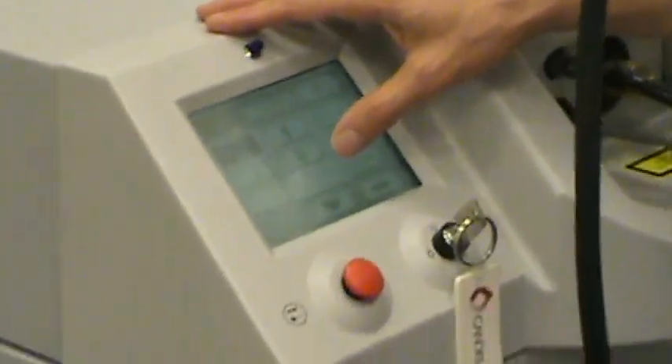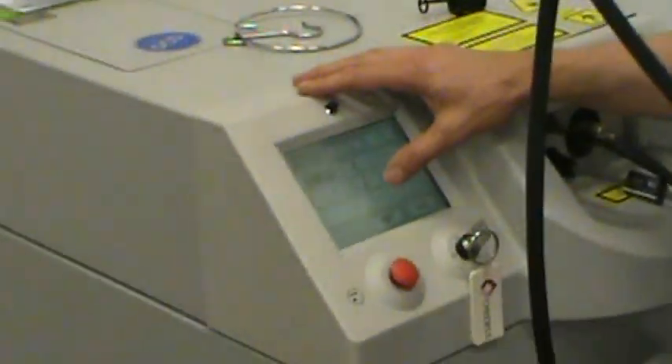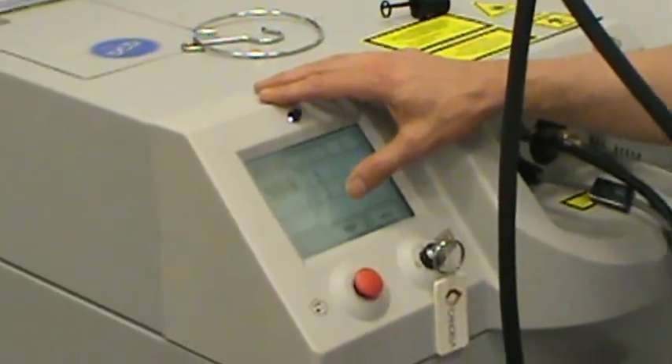There are different components to this laser. One of them is the pulse duration. For this lesion, it's a little bit larger, so we're going to use a little bit longer pulse duration. Pulse duration is just how long you're heating a spot.